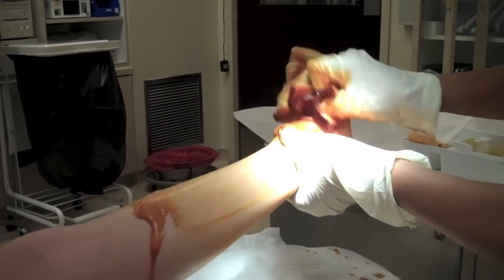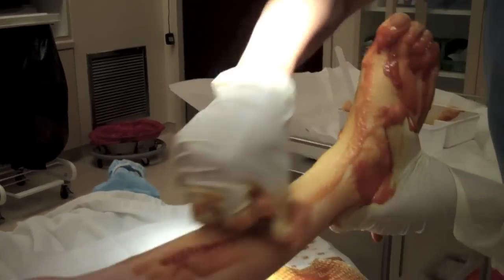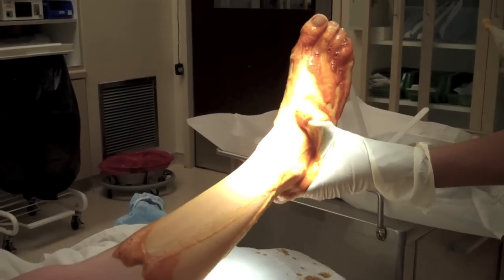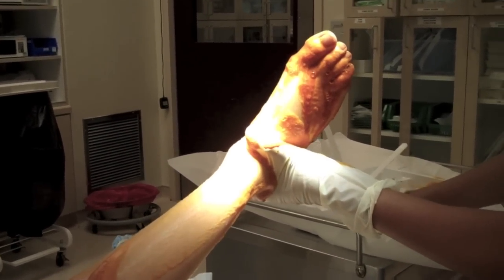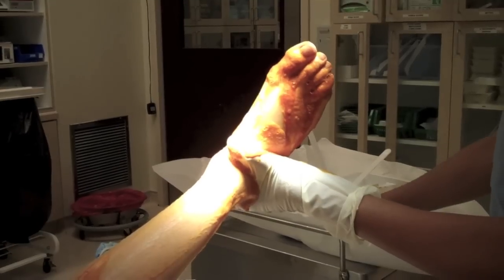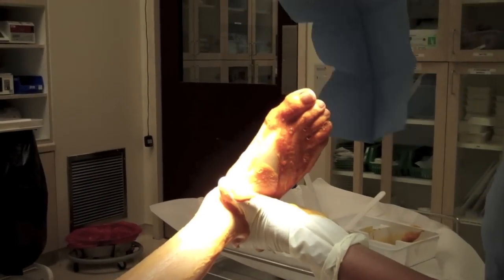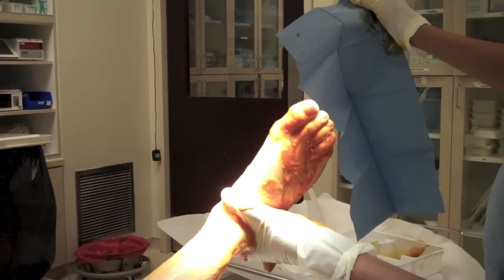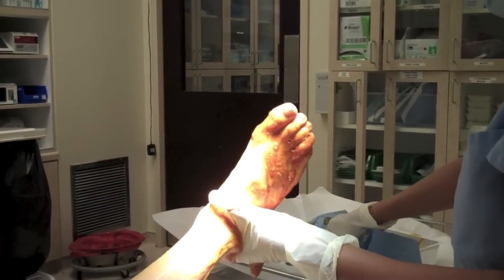This is going to be my last little spray, then I'm going to paint — it's called painting next. This is a towel to dry his foot off first, and then I'm going to paint.